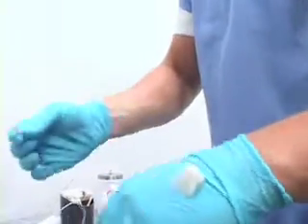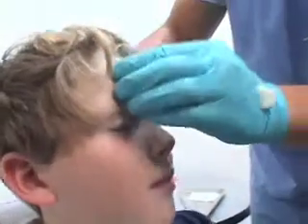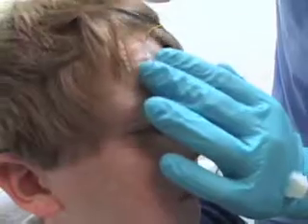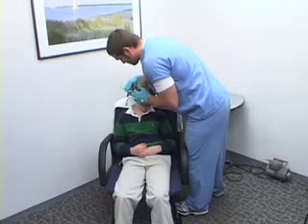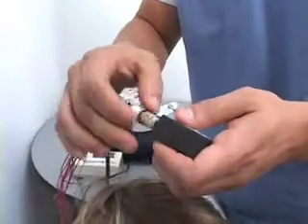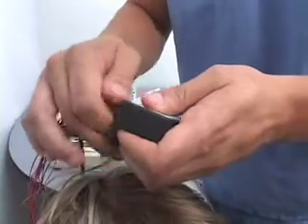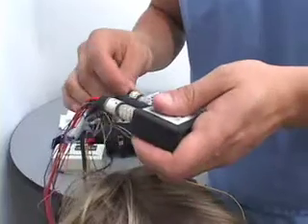16 to 24 electrodes will be placed on your head using a conductive paste and special glue to hold the electrodes in place. But don't worry, the paste and glue will be cleaned from your head at the end of the test. Your electrodes, which are simply small metal discs with thin wires, will be connected to a miniaturized head-mounted amplifier, which collects electrical signals produced by the brain.